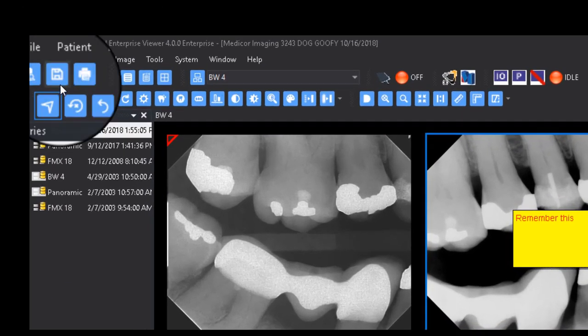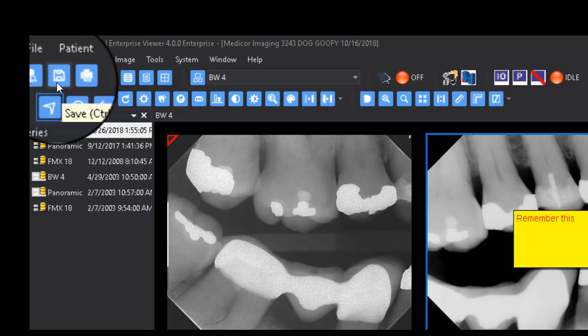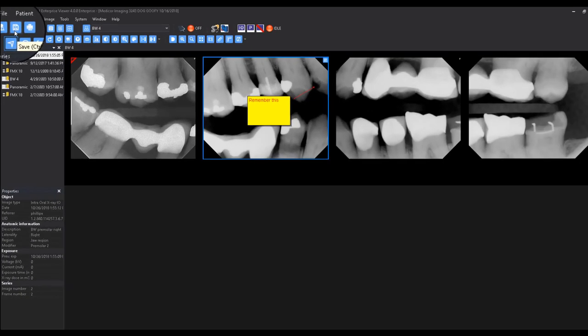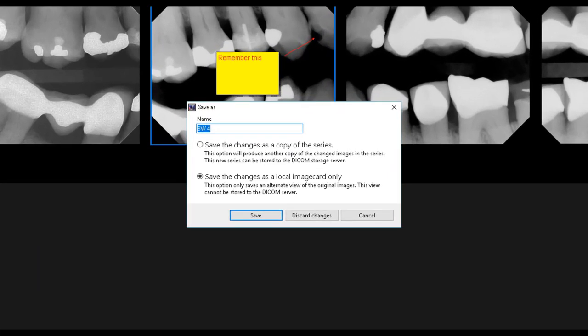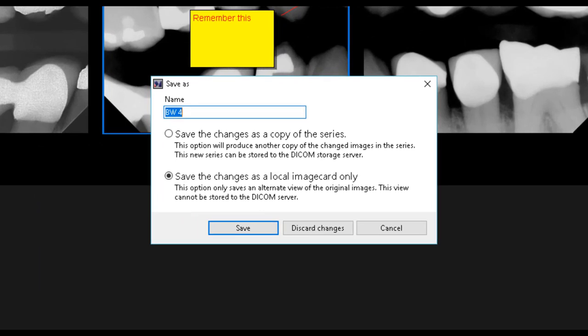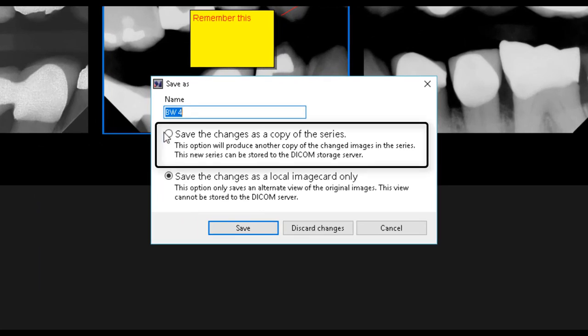If you would like to save the changes, you can still accomplish this by selecting the save button, but the series will be saved as an additional derived series. You will be prompted to save the series as a derived series or a local copy.